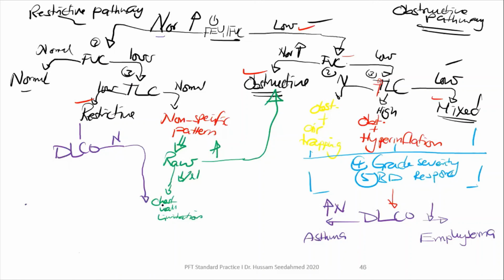These will cause restrictive lung disease. يعني the lungs will be prevented from expanding and relaxing normally. لكن there is no problem with the gas exchange. So a restrictive pattern with normal DLCO, this goes with extra pulmonary restriction.